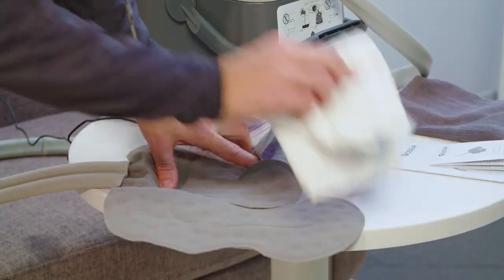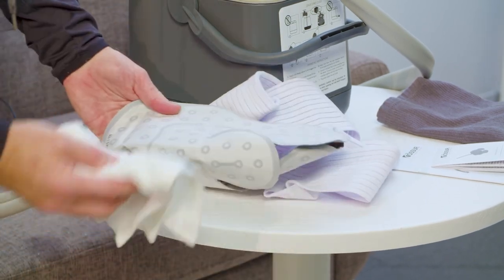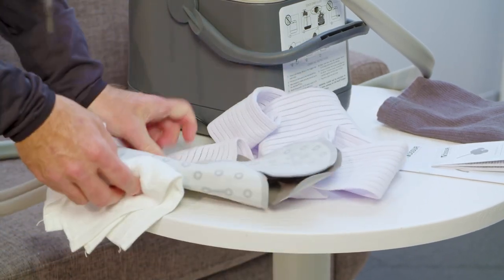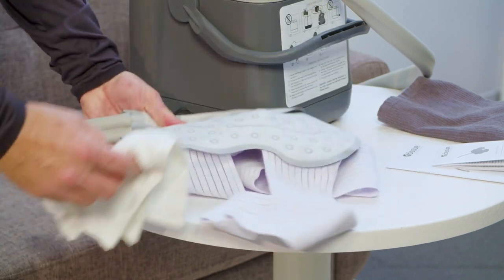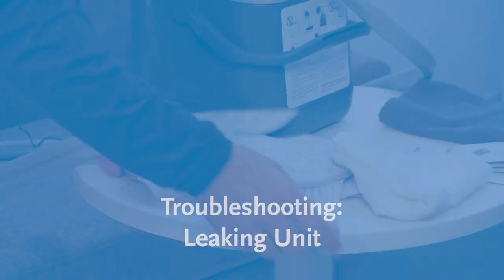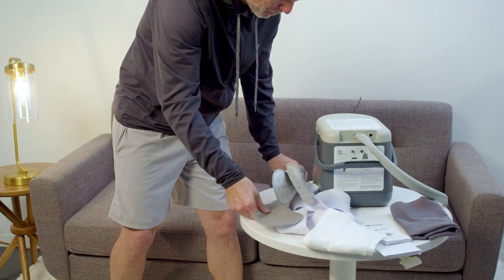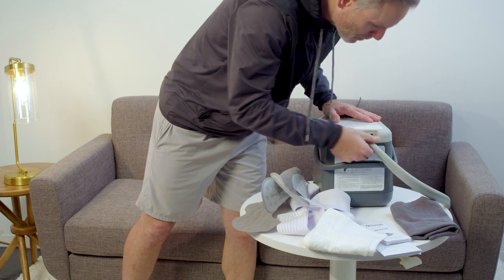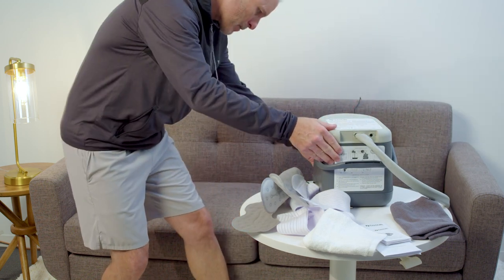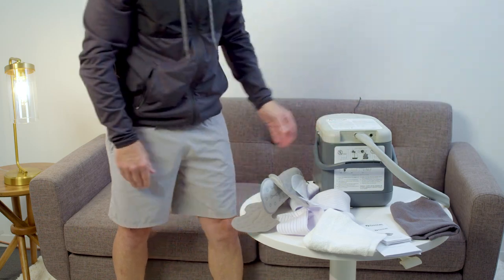Remove the pad, towel dry, and then visually inspect the pad. If a leak is detected, the pad will need to be replaced — see the warranty regarding pad replacement. Visually inspect to determine the location of the leak and refer to the limited warranty for damaged replacement requirements. If no leak is detected, it may be condensation.